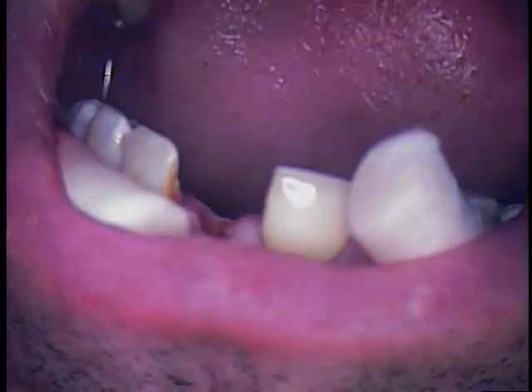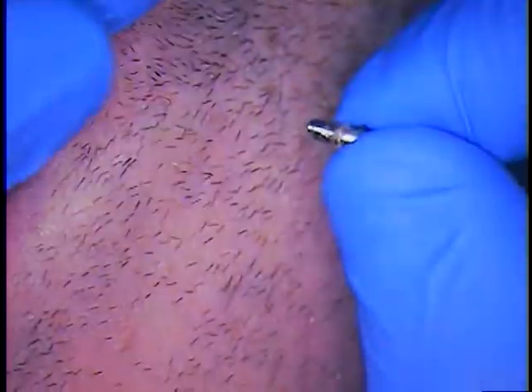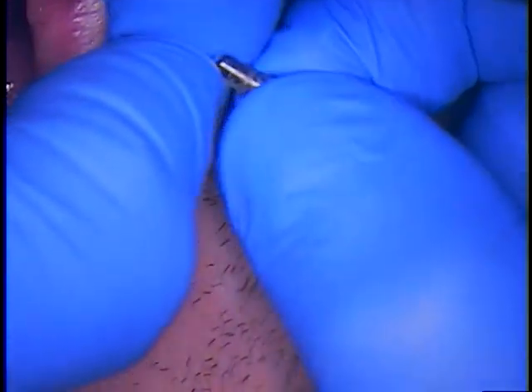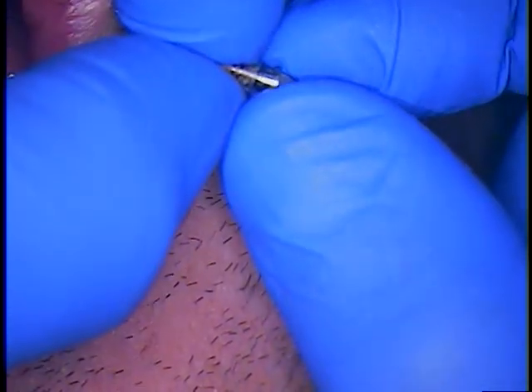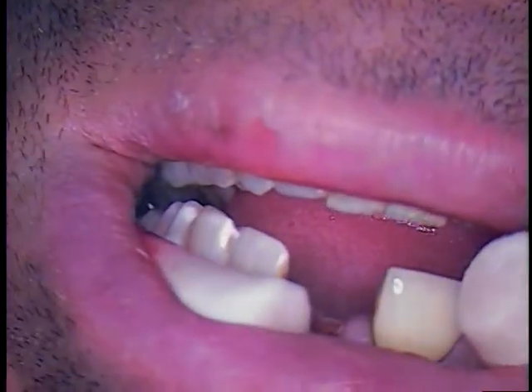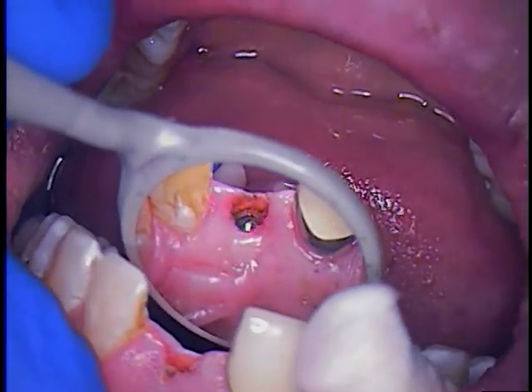Double checking, there's a lot of debris down inside. We can also measure this now. But I'm going to be looking for that sleeve. All right. Otherwise, this is right down onto the implant. We'll investigate this in a little bit. Let's put that aside in a box. Looking down inside, we'll explore with an explorer.